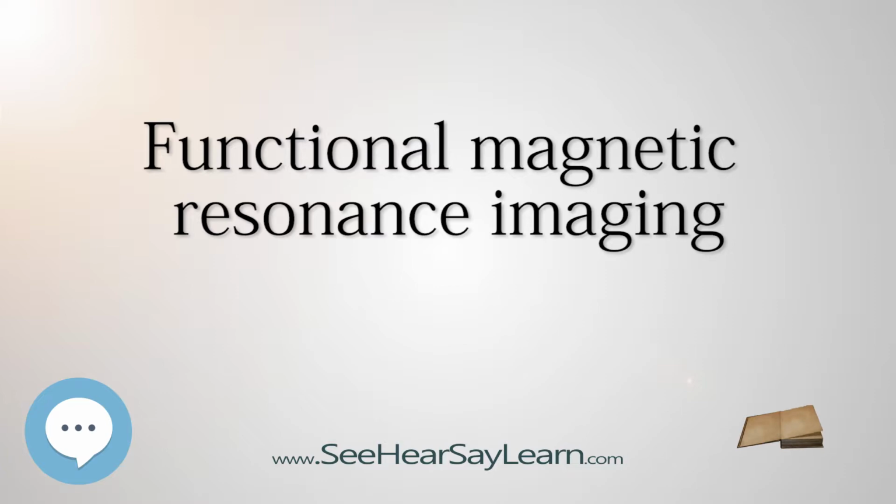Pulse sequences sensitive to T2* show more MR signal where blood is highly oxygenated and less where it is not. This effect increases with the square of the strength of the magnetic field. The fMRI signal hence needs both a strong magnetic field, 1.5 T or higher, and a pulse sequence such as EPI, which is sensitive to T2* contrast.